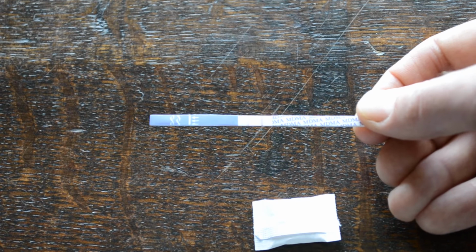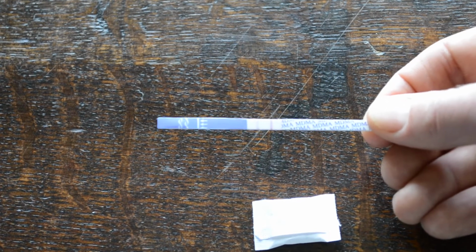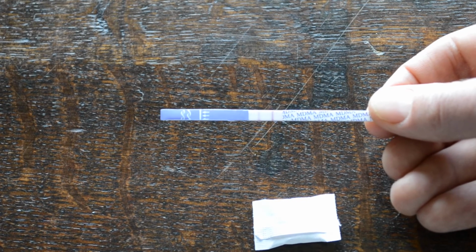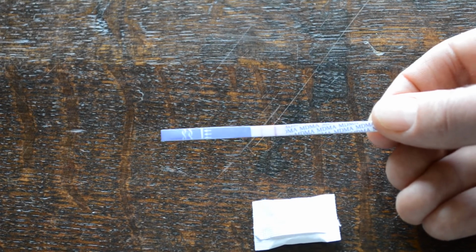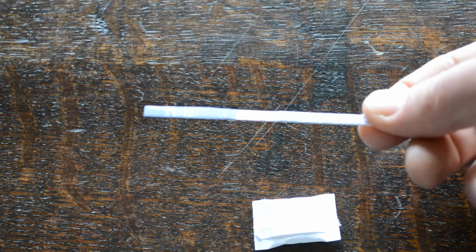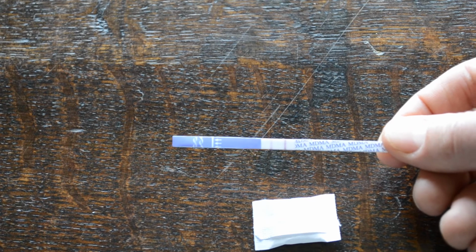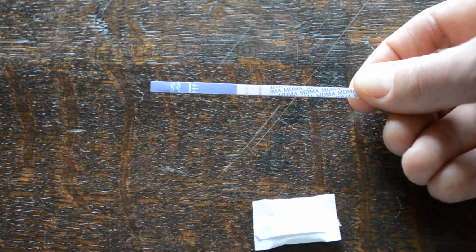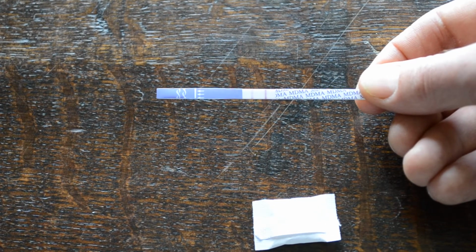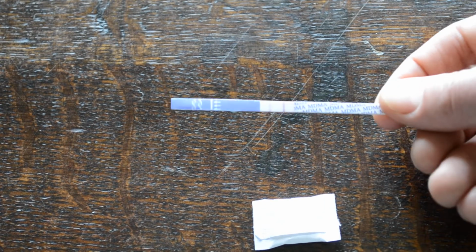The beauty of these tests and the way they've set them up is that, with this test result you saw it develop almost immediately as a clear negative result, and at that stage there's no need to wait for the full 8 minutes before you move on to the next test. That can be interpreted as a clear negative result, and you can move on and do the next test. So they really are 1 to 2 minutes in most cases before you get your test results, so very quick to perform, very easy to read.